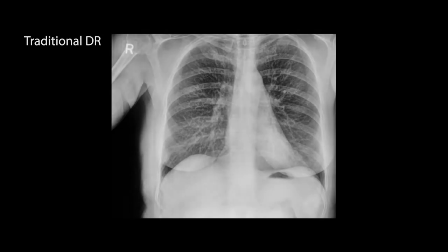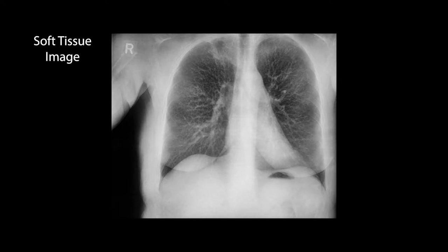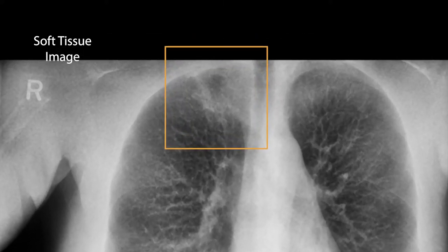The radiologist reviewing this PA chest x-ray image commented on a bilateral interstitial change with peribronchial cuffing. However, the image was deemed to be otherwise clear of anomalies. In contrast, in the soft tissue dual energy x-ray image, an apical lesion was discovered in the right upper lobe that was not seen in the conventional chest x-ray image.